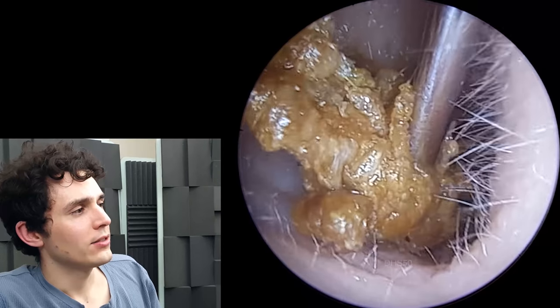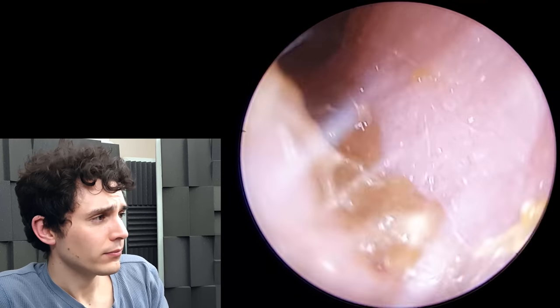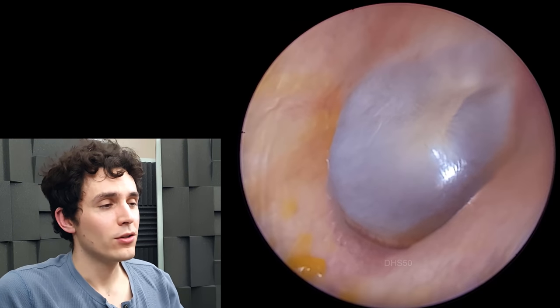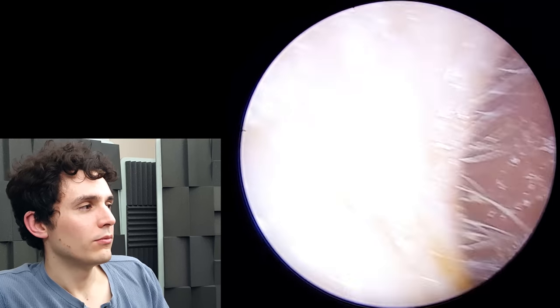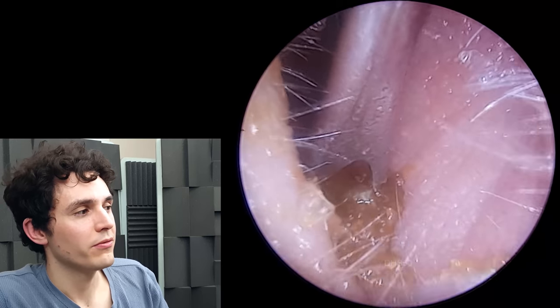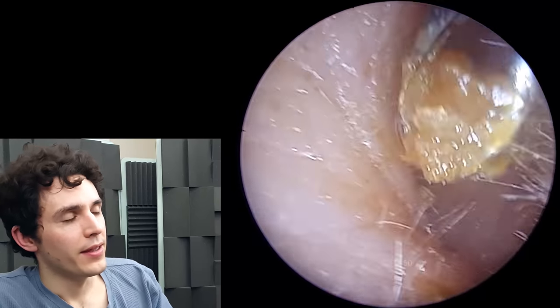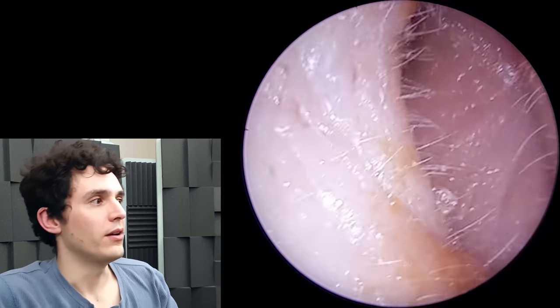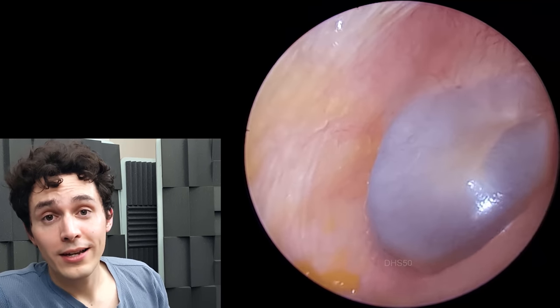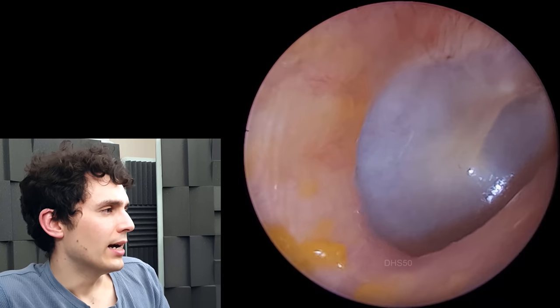Here we go — second scoop — an enormous amount of debris removed there very easily. That's really why the Formby scoop is good, but not used that often, because it's really so large that you can only use it in these particular cases where you just need to grab stuff and yank it out of the canal. Any deeper than that and it's just too large — it would be like moving an elephant through a narrow corridor. The bigger the instrument, the more likely you are to bump up against something or scrape something, so it's just not worth it.